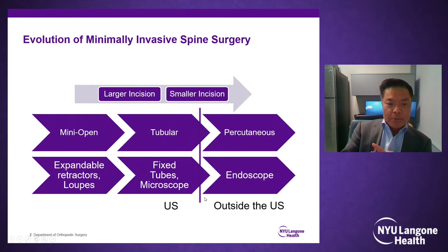Okay. So, evolution of minimally invasive spine surgery. Traditionally, spine surgery was done via a midline approach, right? Whether it's cervical, thoracic, or lumbar. Particularly if it's a posterior approach, everything was done midline: cut the skin, get down to the bone, strip the muscle, and open everything. And then we realized, hey, maybe we don't have to do all that opening and stripping. Maybe perhaps we could just open small areas of the spine and do the same thing.